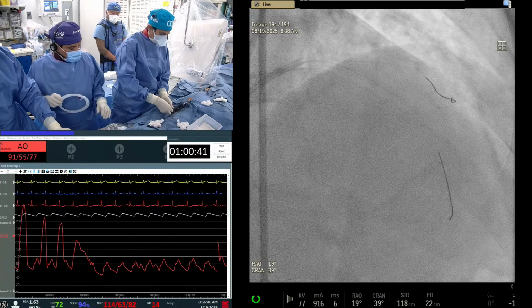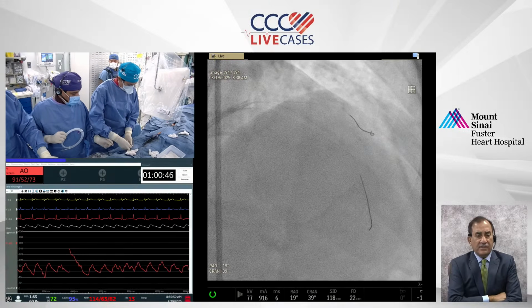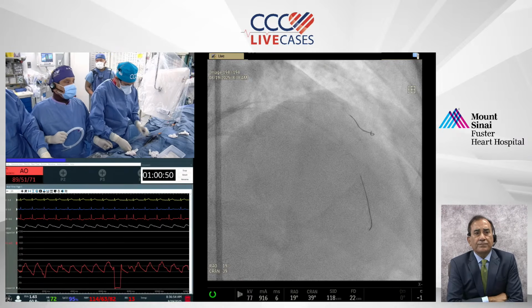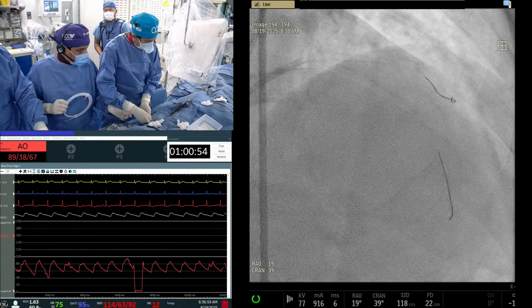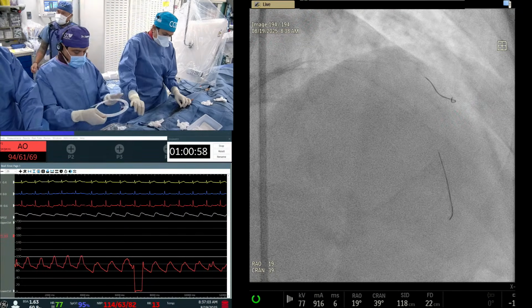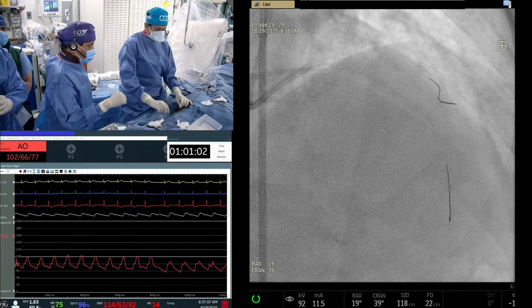So my summary of this case so far is that the extent of disease has been quite impressive. Now, diagonal, we remember that's the question I asked in the beginning, which AK said is very likely going to be predicted, that it'll require, by every criteria of the definition, 2 stents.